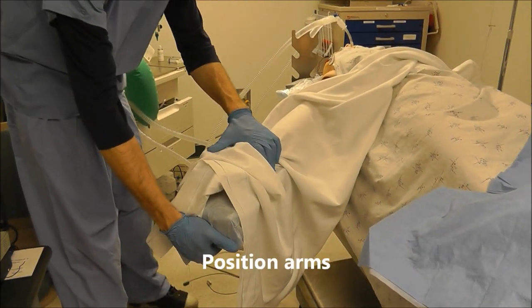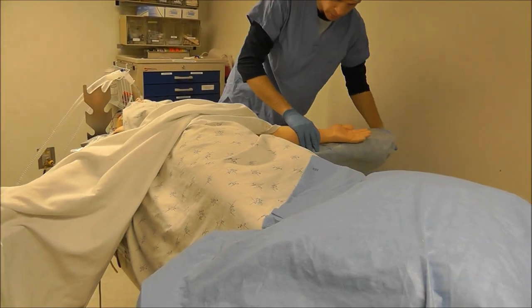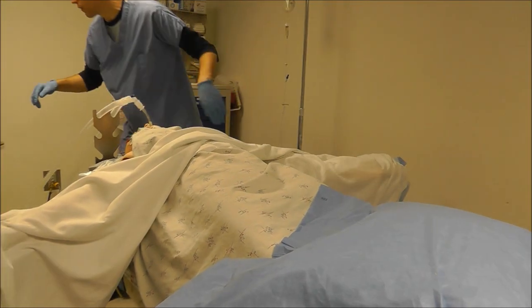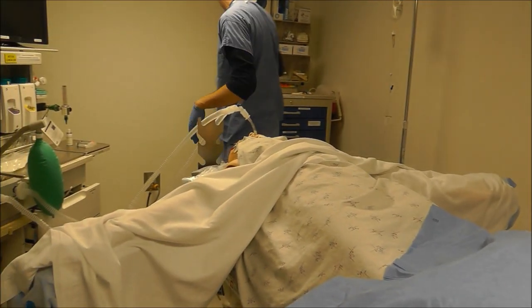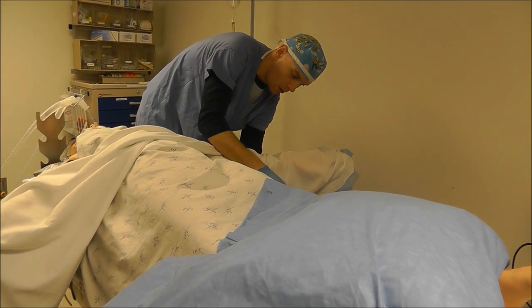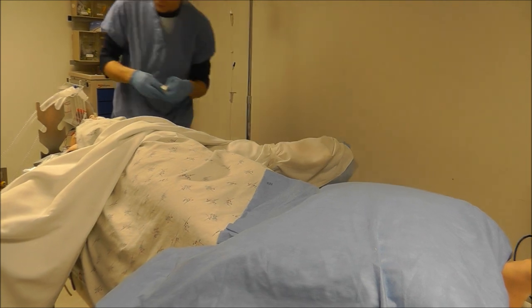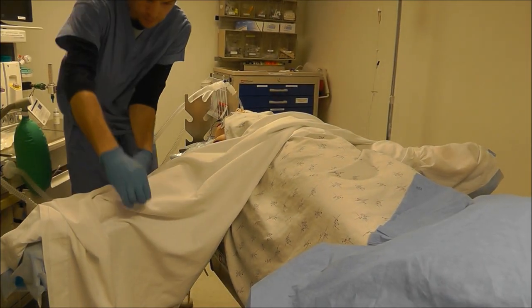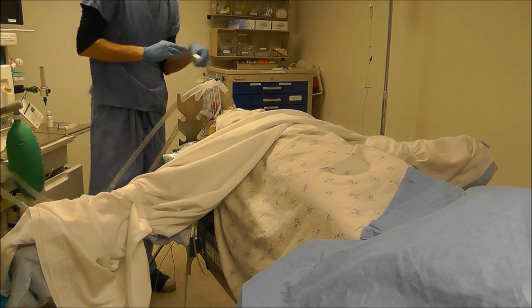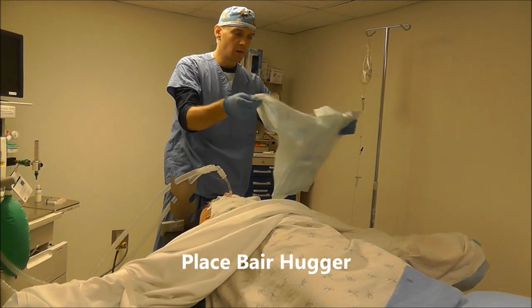Once that's done, you're going to want to make sure that you come over here and position the arms. Once the arms are positioned, we want to secure them into place. Make sure they're positioned properly, and then we'll want to make sure that we put on a bear hugger.